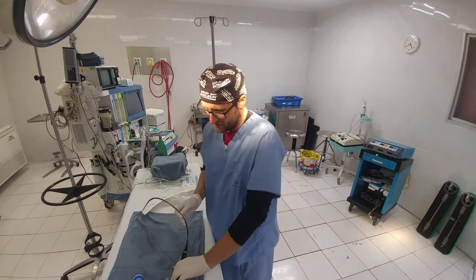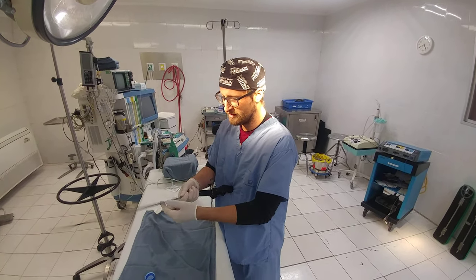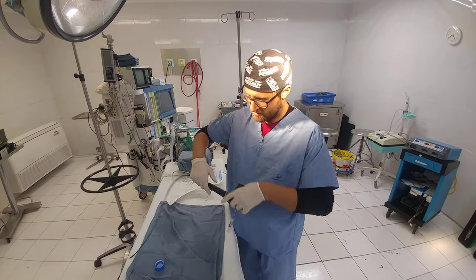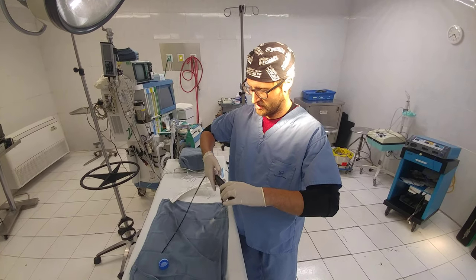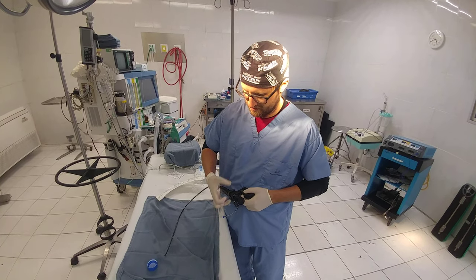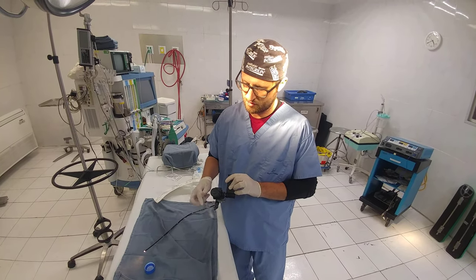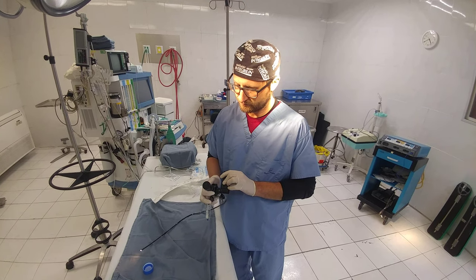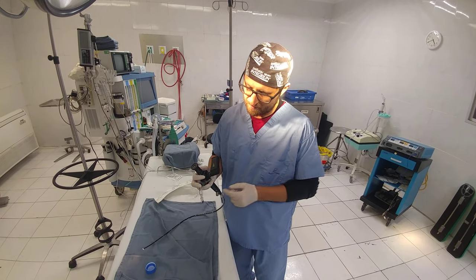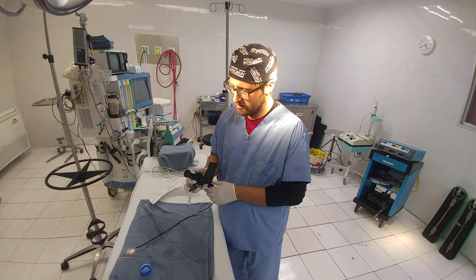I don't know how long that took. It seems to take too long. And since I'm a little wuss, I'm using a 5.5 here. Let me get my scope loaded up — I've practiced just doing this with one hand, doing my injection and control.